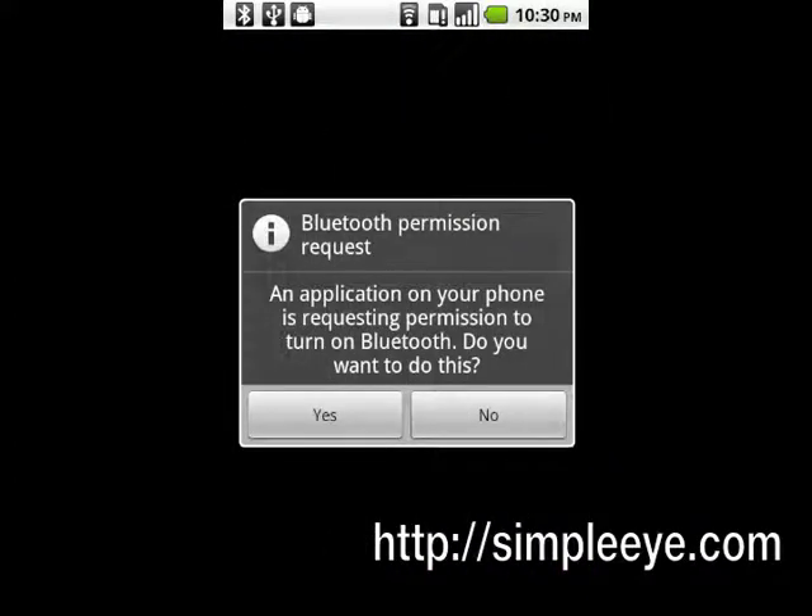Bluetooth must be activated to communicate with the Bluetooth pulse oximeters. If Bluetooth is not enabled, the application will request that Bluetooth be turned on. Tap Yes. Bluetooth will now turn on.